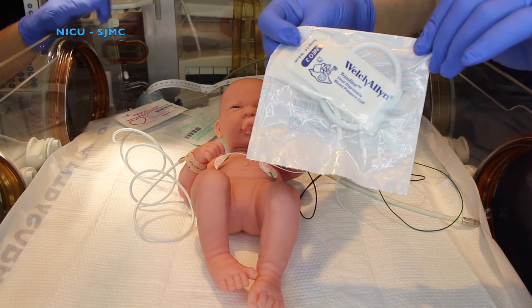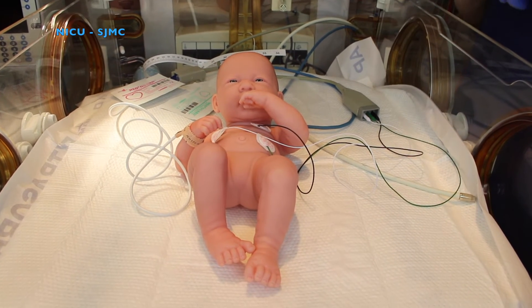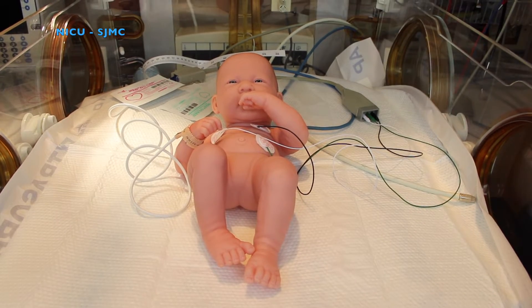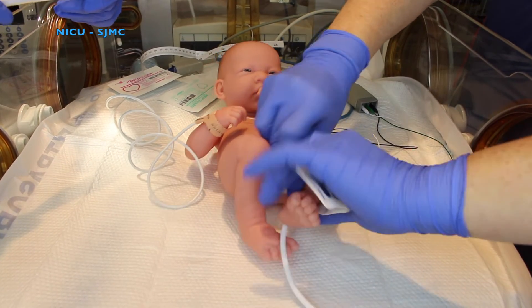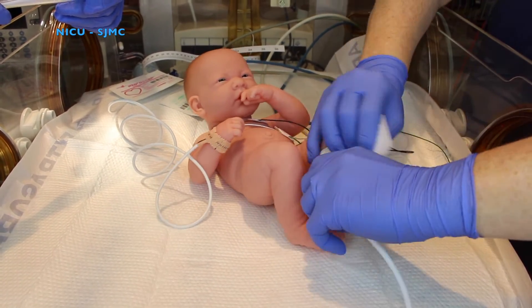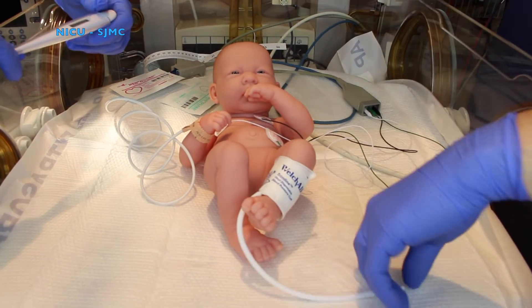Next, you'll place your blood pressure cuff on your baby to get your blood pressure. You can take blood pressure on the calf or on the baby's arm. For demonstration purposes, we're going to use the calf.